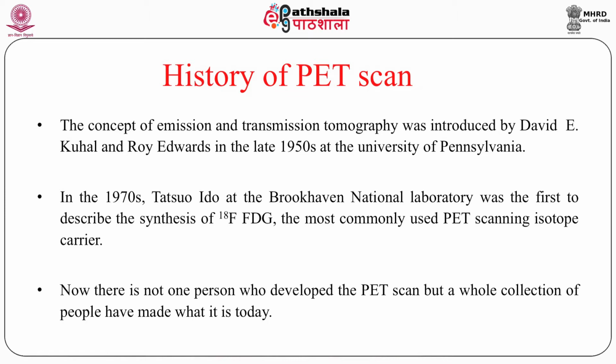If you see the concept of emission and transmission tomography, this was introduced by David E. Kuhl, a scientist, the brain behind it, and Roy Edwards in the late 1950s at the University of Pennsylvania.